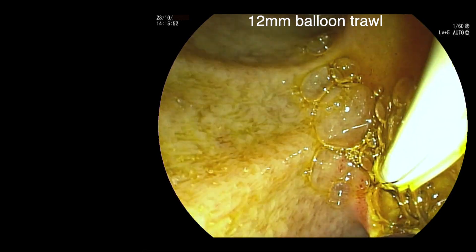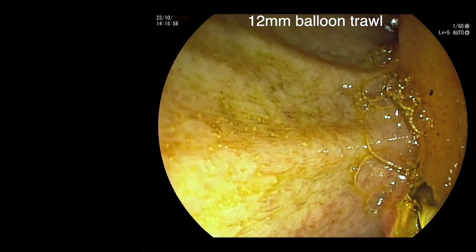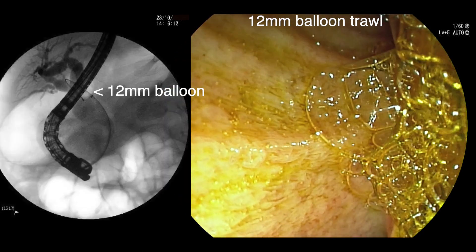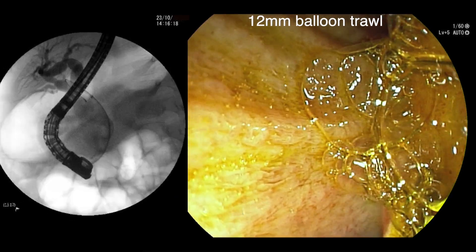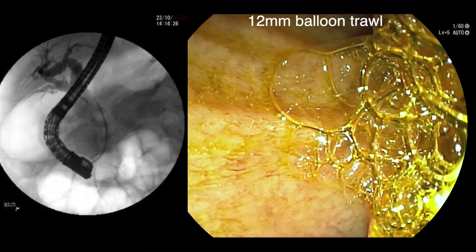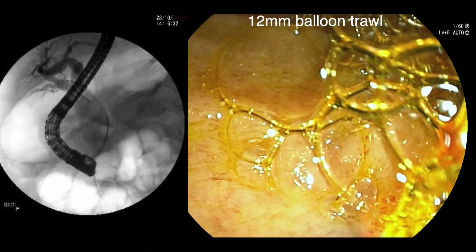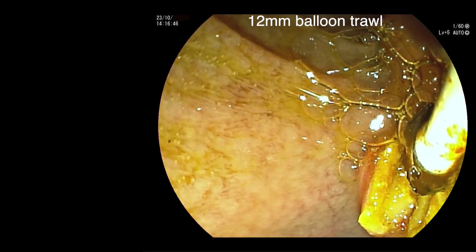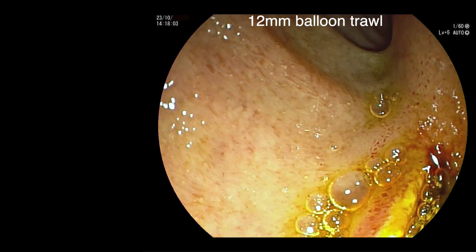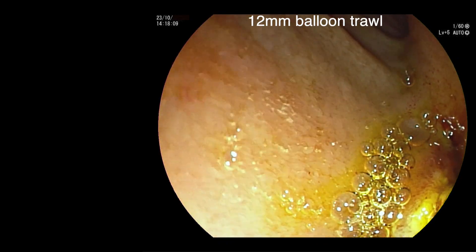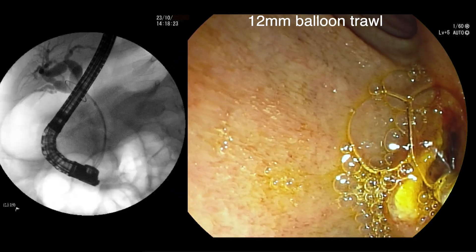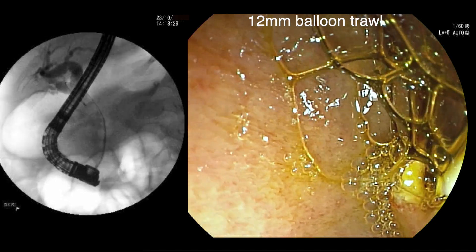A 9-12mm balloon catheter is used to trawl the bile duct. The balloon is inflated to 12mm and pulled out through the papilla. Some sludge and other debris comes out with the first pull. It is noted that the 12mm balloon travels through the stricture quite easily, as we would expect with external compression by a cyst.